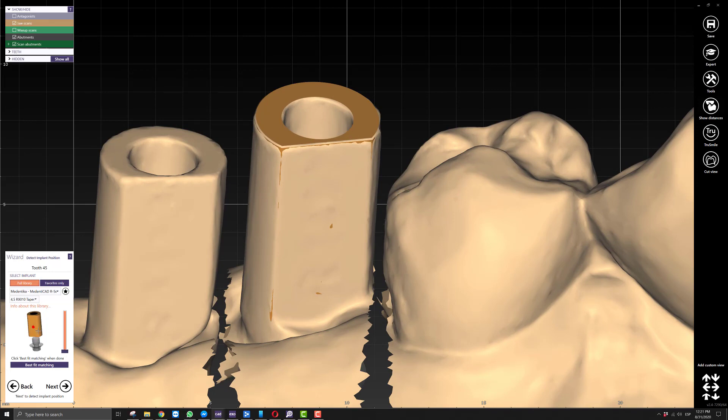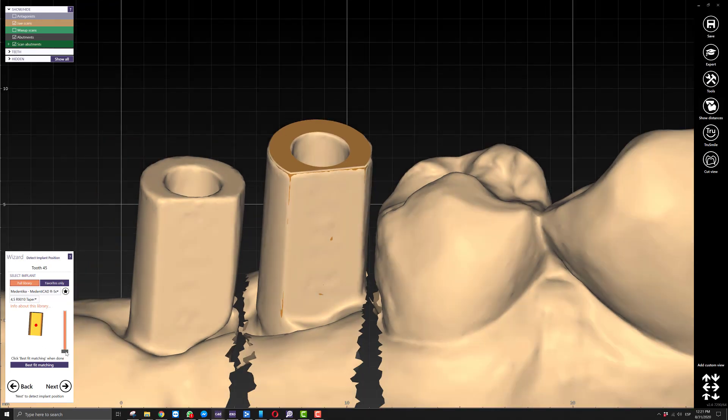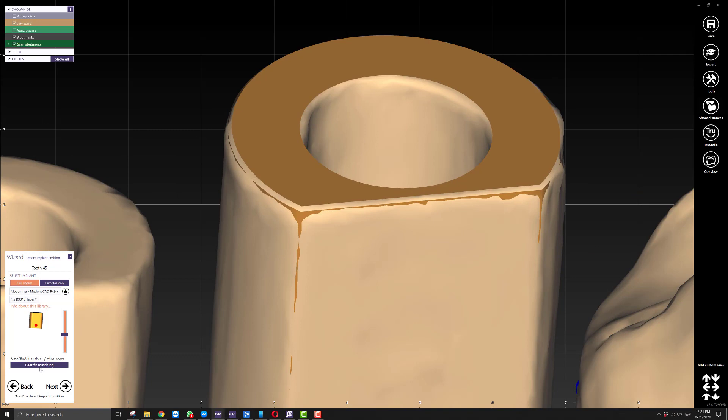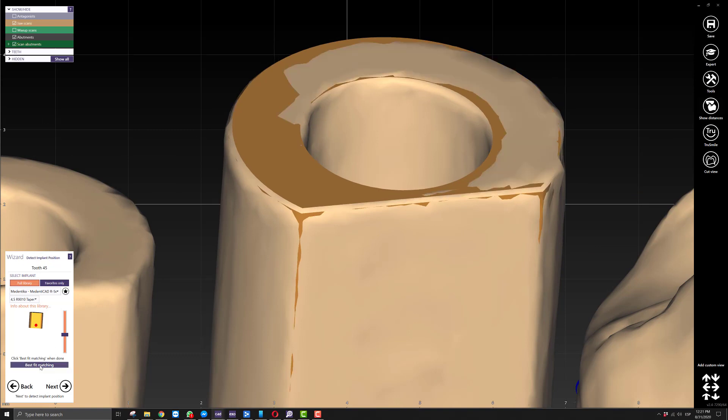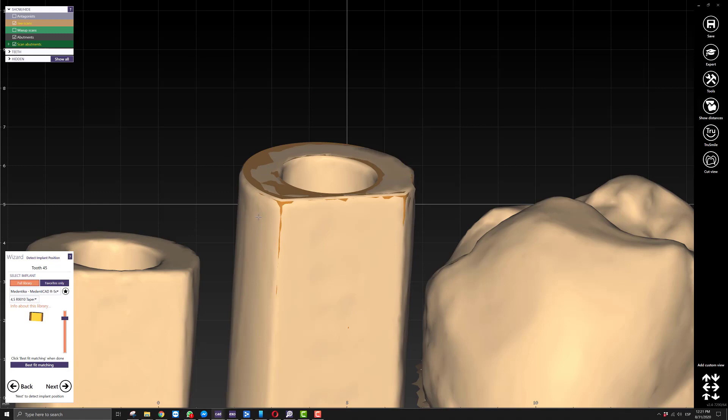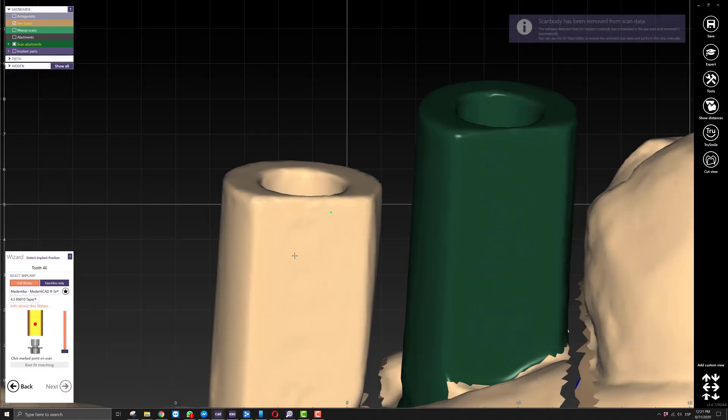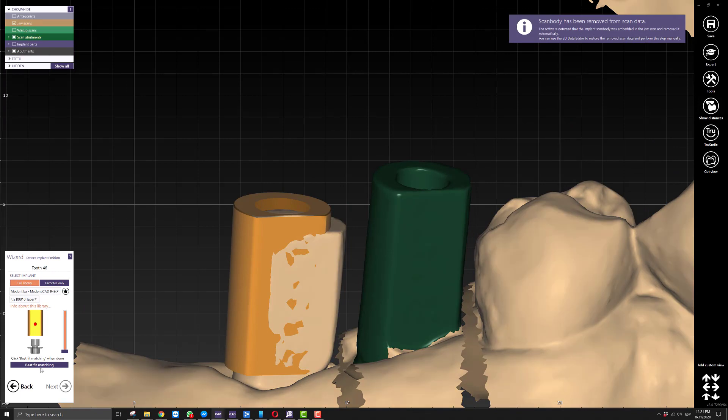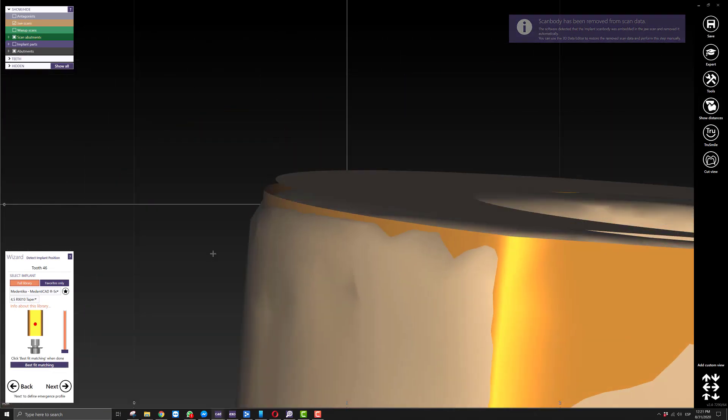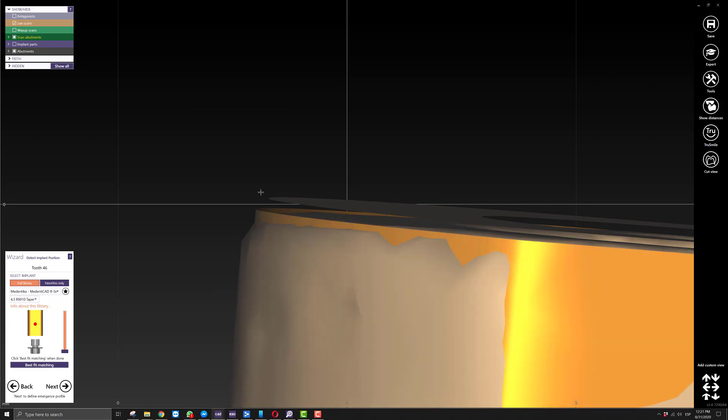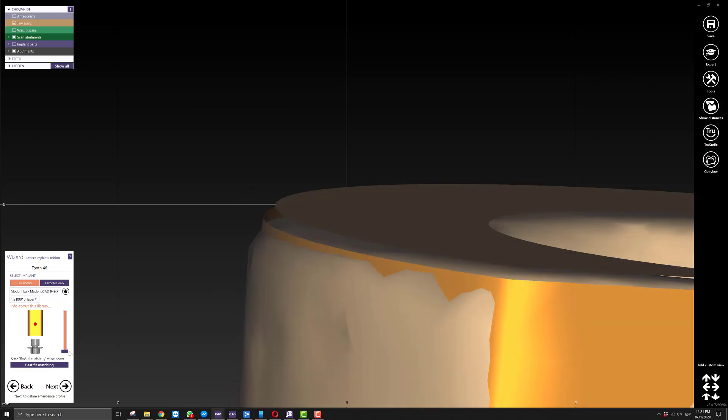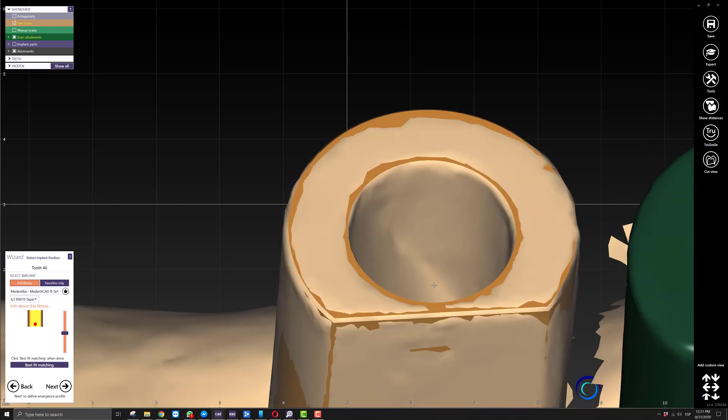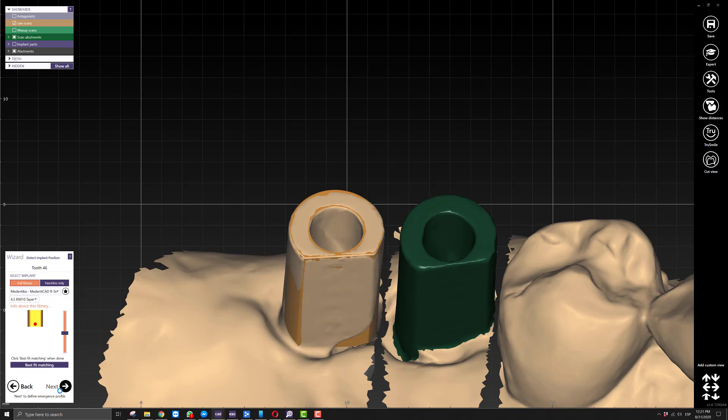What you want to do is have the software, instead of looking for everything we're visualizing here including the tie base, reduce the amount of information it has to look for. I'll reduce it this much, and then when I click best fit matching, my alignment is better. The same thing is going to happen to this implant because it's deeper into the tissue, so it's off by more than the previous one. I'm going to hide a little bit of this, and my alignment is a lot better. Just a quick tip there.